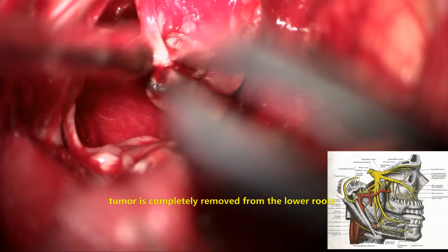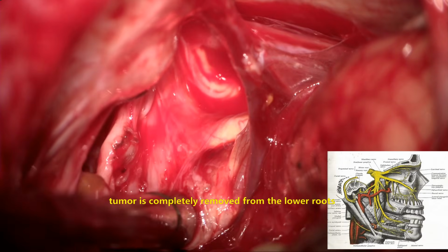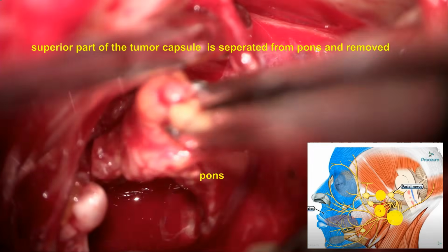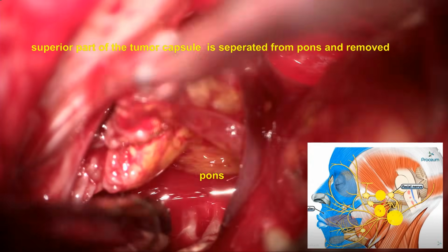Now the medial-most part of the tumor from the anterior part of the pons, medulla, and midbrain is being gently dissected and removed.